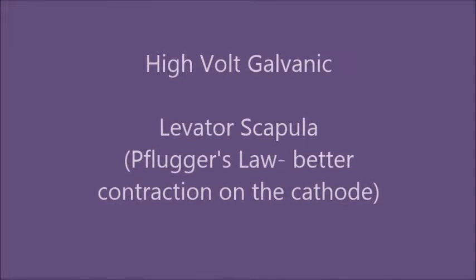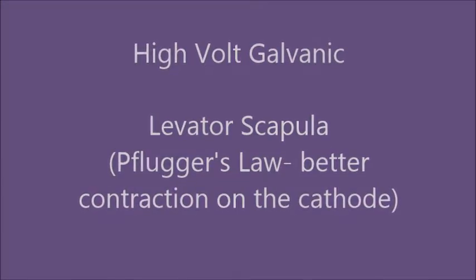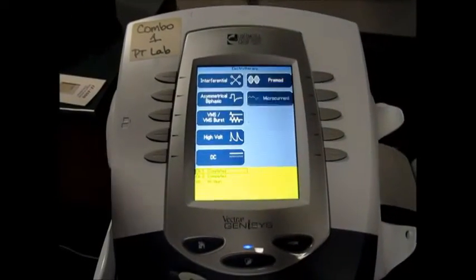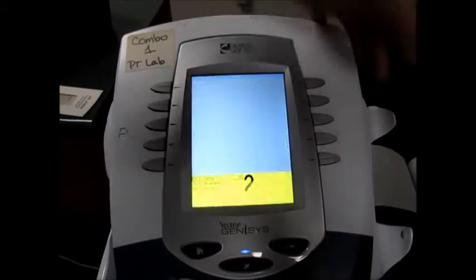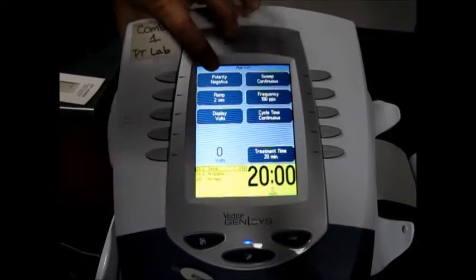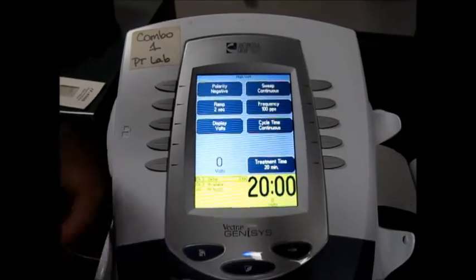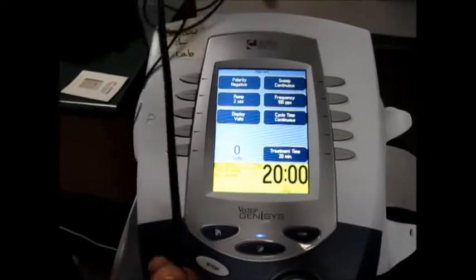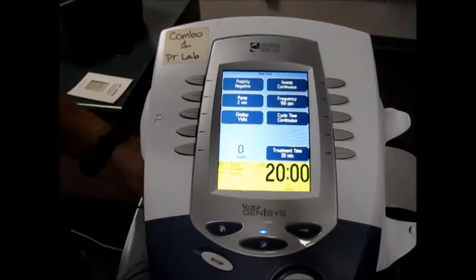High Volt Galvanic on the levator scapula, showing Pflugger's law — better action potential on the cathode. I'm going to show how changing the high volt cathode and anode, in terms of where the active pad is, affects the response. I currently have polarity set to negative, which on the Chattanooga unit is on the red lead instead of the black lead. That's just the rule of this particular unit. This happens to be channel number two.